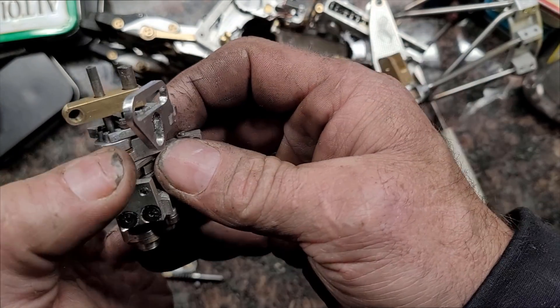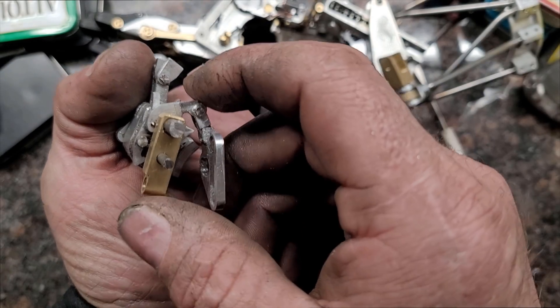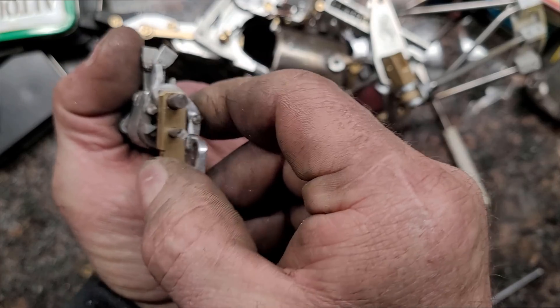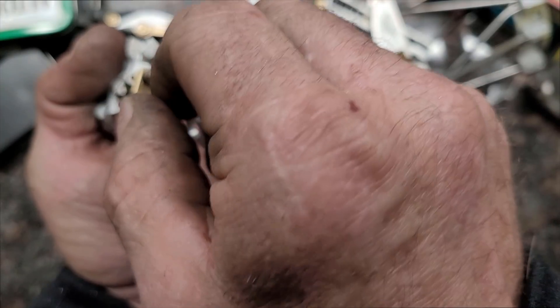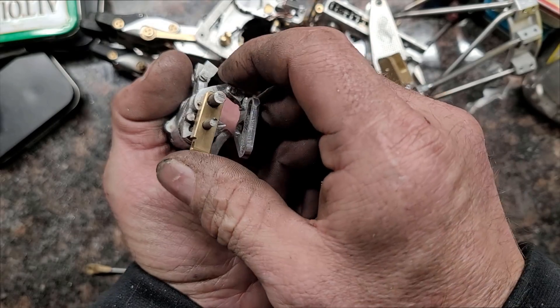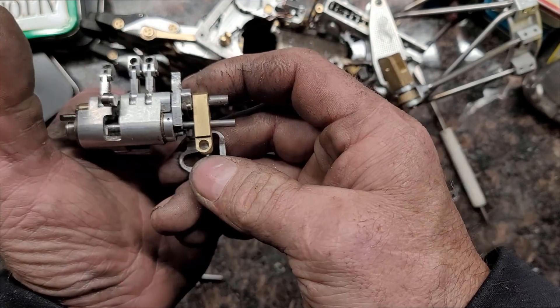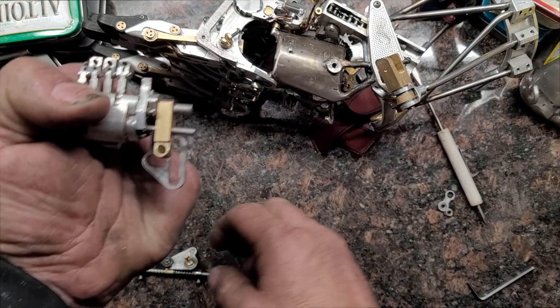You have a catch and you have a lock. What the catch does is it goes down to the next position and comes up, and then the lock takes over and keeps the cam from rotating backwards — so catches, locks, catches, locks, catches, locks.